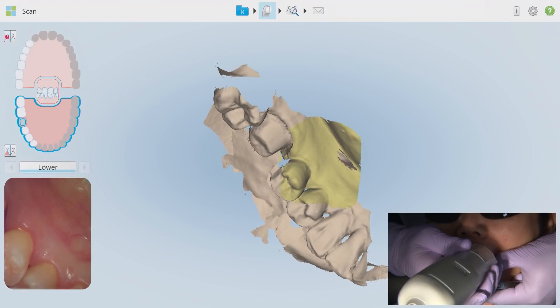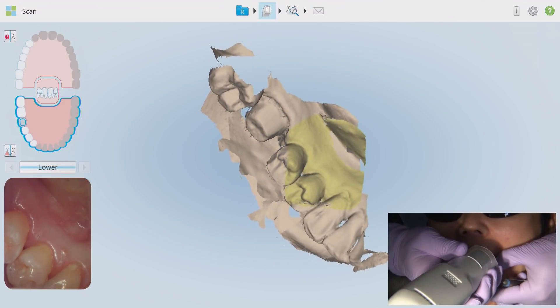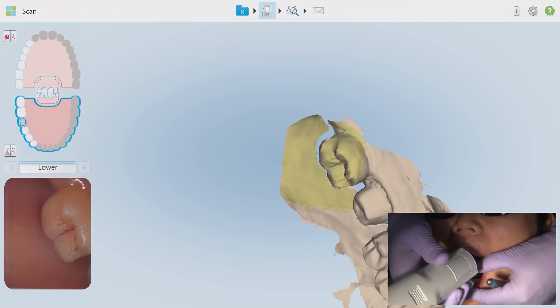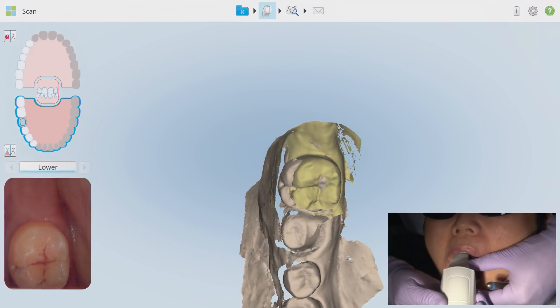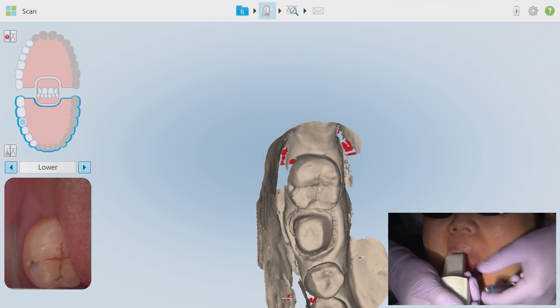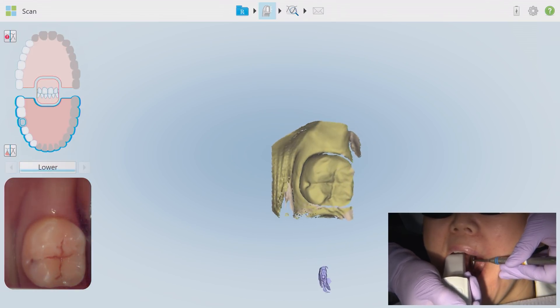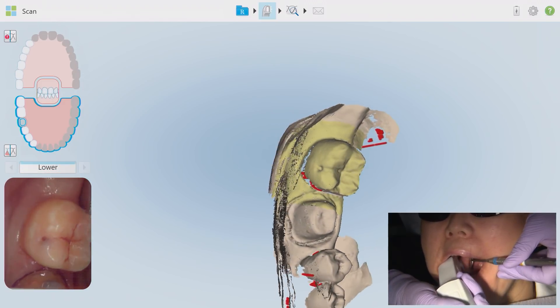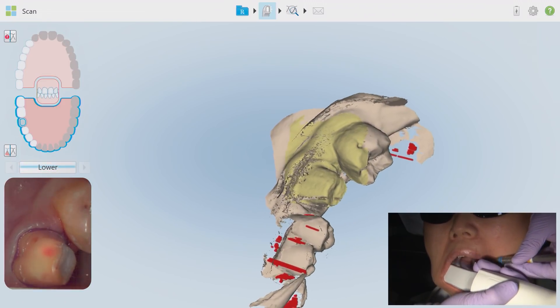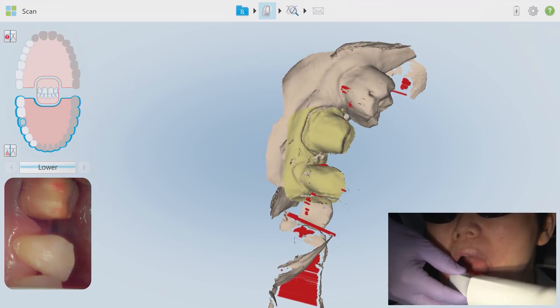I'm using an underhand grasp with fingers facing upwards, making exaggerated, bold, purpose-driven twisting movements to capture difficult-to-reach embrasure and contact areas. If you are having trouble acquiring interproximal anatomy, first check for saliva contamination and then increase the angles of your exaggerated twisting motion. Once I reach my start point just distal to the most posterior tooth, I'll stop the scan and reset for the buccal anatomy. Start the buccal scan on the occlusal surface first, let the iTero mesh the new scan with already acquired information, then work toward the anterior to capture buccal data. A similar exaggerated rocking motion — almost lifting and dropping the tail end — captures the buccal embrasures and contours.